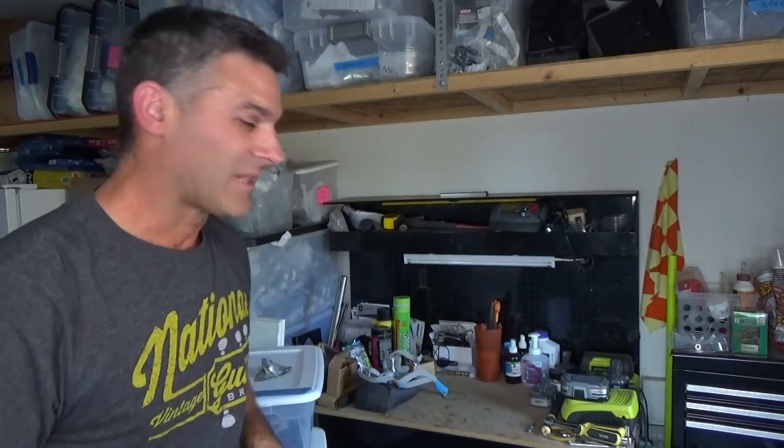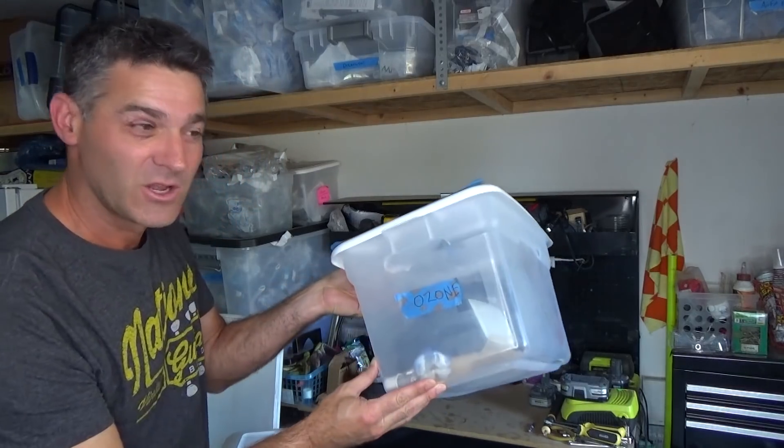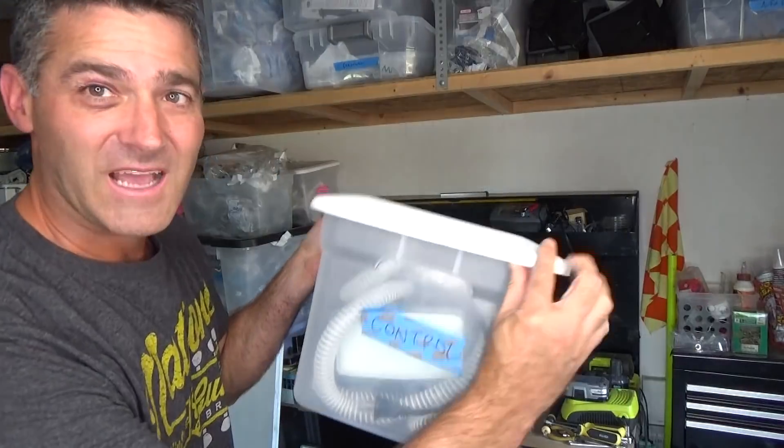We're in front of my workbench. Every time we're in front of my workbench, something magical happens. Last time we were here, we checked out my little strawberry plant behind us — I do have a couple strawberry plants back there. But we also did an ozone test. We had a control box and an ozone box. I still have those boxes right here. This one we pumped full of ozone. This one we pumped full of nothing — we did nothing to it.